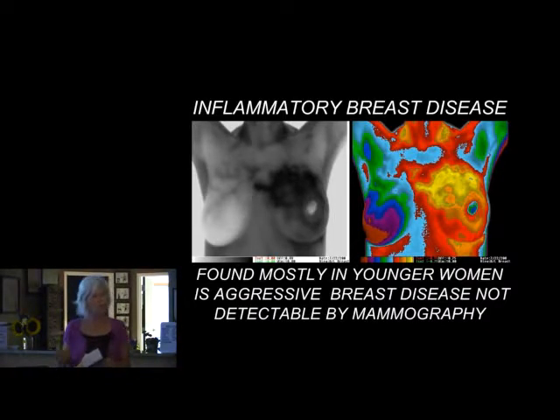The sooner you can establish a baseline, you can feel confident, a baseline with a couple of images where the numbers are stable. There are no significant heat differences. All your numbers are stable. That's indicative that you've got healthy breasts, you're stable. And then again, just do this once a year. But this is what it looks like, and by the time it shows up as a rash, then it's an aggressive form of disease, unfortunately.